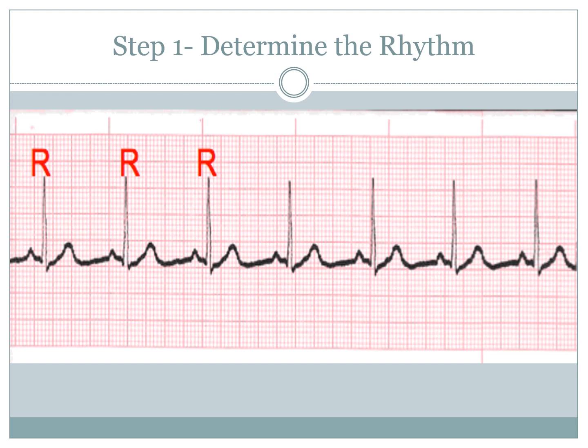When you get irregularly irregular, that's when you get your random PVCs. That's where you get random beats, no correlation between P's and Q's, and just no consistency within the spacing between the beats. That's the difference. I recommend that you always start with the QRS because it's just easier. Then when you look at the P wave, look at the intervals between the P waves as well, because that will help you determine certain arrhythmias.